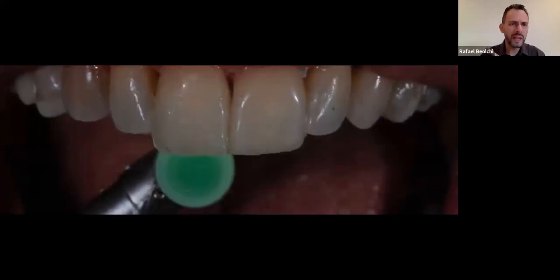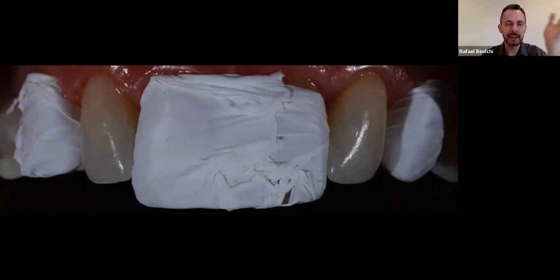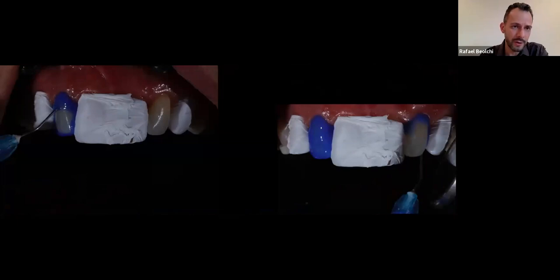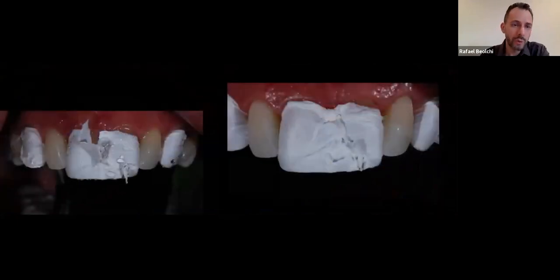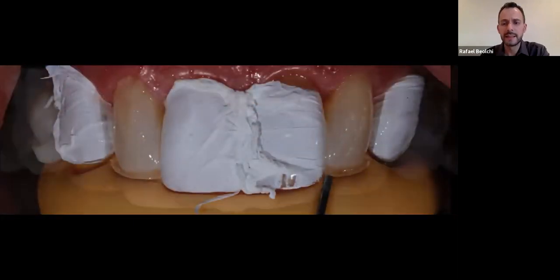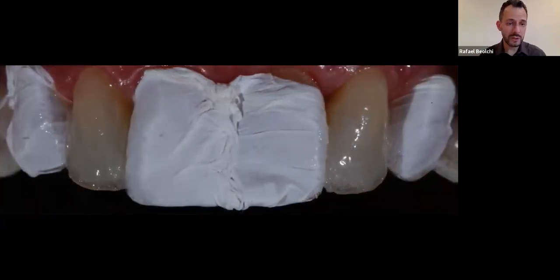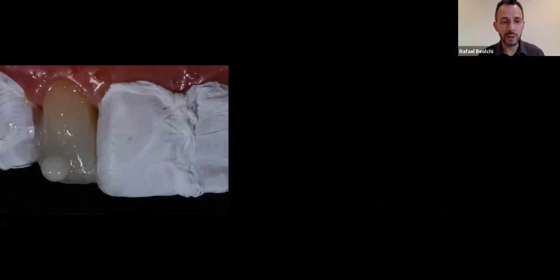So what I'm going to do is a quick finishing. I'm not doing the finishing and the polishing, just a quick finishing only to get into the next pair of teeth, the lateral incisors. Same things, guys: etching, washing, drying a lot, applying the bonding system, which should look moist, applying the palatal, then the proximals, freehand. Proximals must be done freehand. There's no other way. This little pellet here is the enamel color that I'm going to spread.